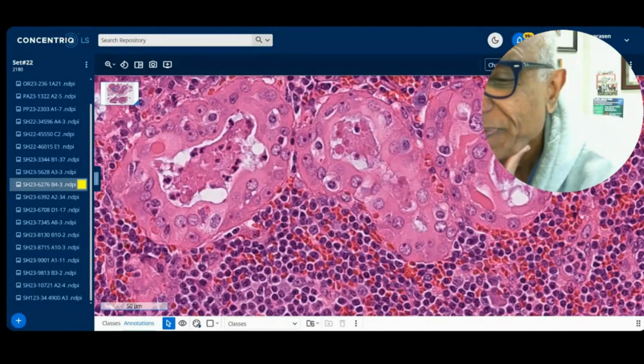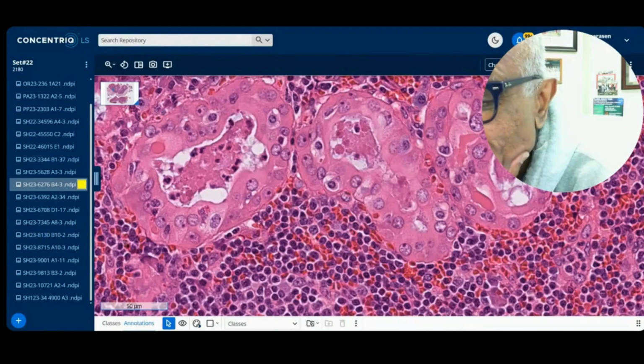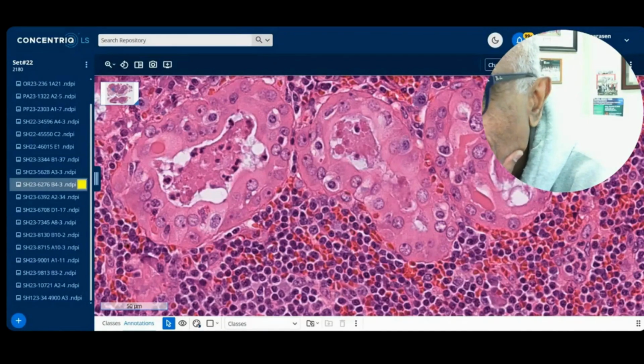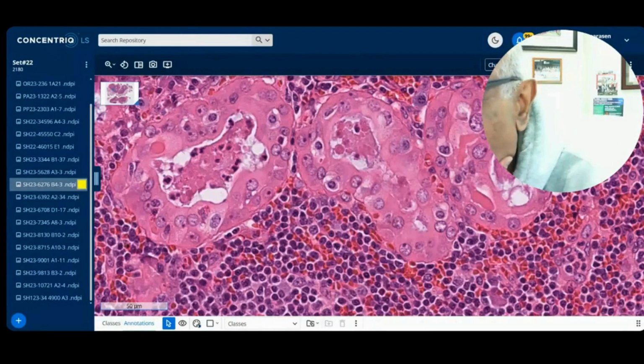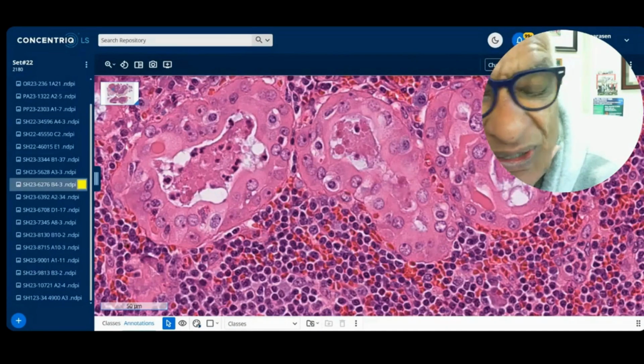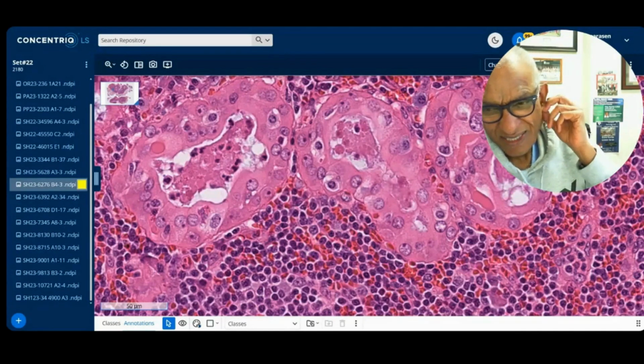I don't know if Omar has told me what he was thinking about ciliated. Oncocytic cystadenoma, yeah, those have been described, Andy. I had one late last year. It's in one of my other slide collections. Yan, I think you mean mucoepidermoid, not mucoepithelium. But how do you explain these features, Yan? You say mucoepidermoid carcinoma query, right?